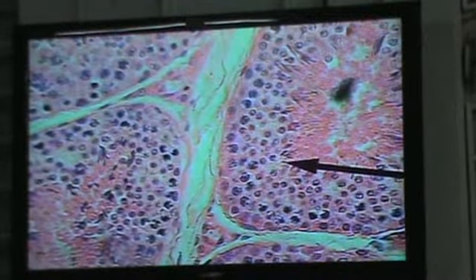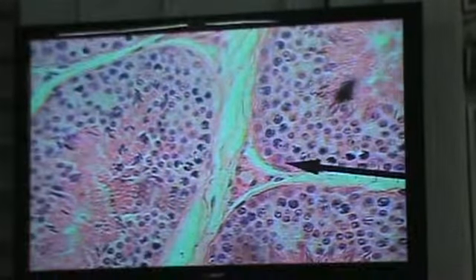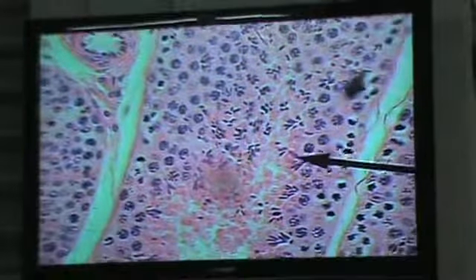Now, from there, we lead into what I refer to as the what? The spermatocytes. Okay? So there you can see now a lot of division occurring here. So we'll ask you to identify the spermatogonia. Alright? And then we need to identify the spermatocytes. So all of these guys here are spermatocytes. From here going right all the way to here, these are all spermatocytes, till we reach this point here, or till we reach right over here.